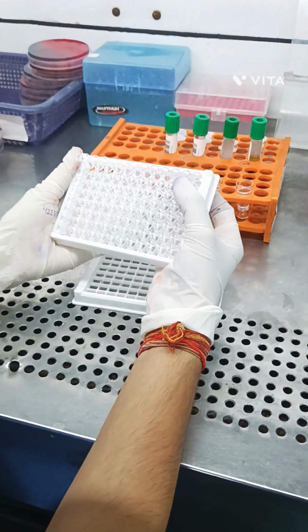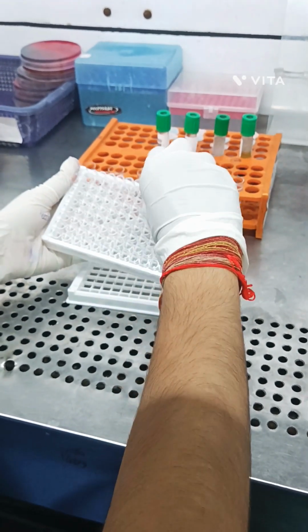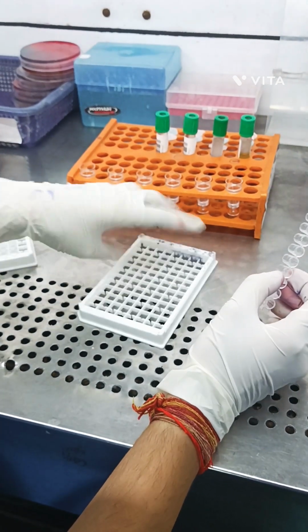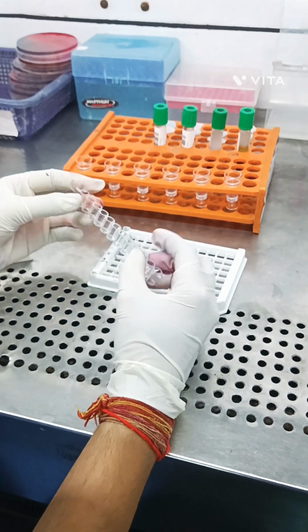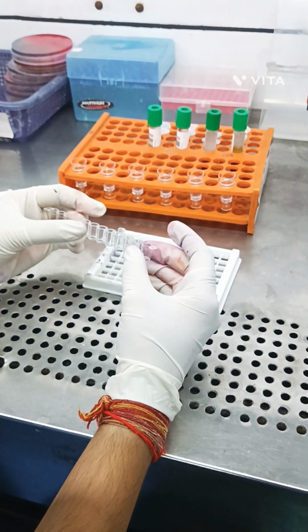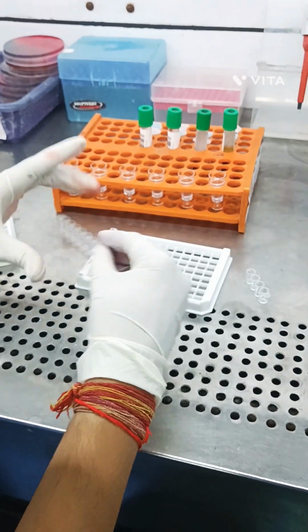Next step, we have to dilute the standards and reconstitute the standards. So first we have to take wells. According to how many samples we have, and standards 1 to 6, with concentrations from 400 to 12.5.